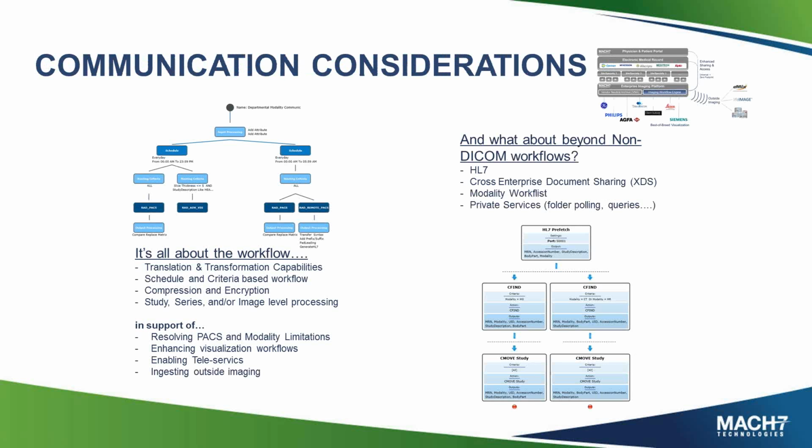From a communication perspective, I've talked about the A in PACS a little bit. Now, the C in PACS, the C in that enterprise imaging platform, how can we optimize the workflows? Again, talking about translating and transforming workflows. Can I have different schedules? Maybe I have a remote site that doesn't have a radiologist on staff after midnight. Can I route it to a different place? Can I auto-generate HL7 orders? Can I fix patient IDs and so forth? Are there ways to do compression and encryption?